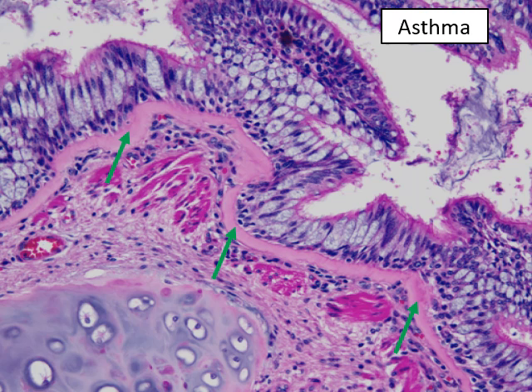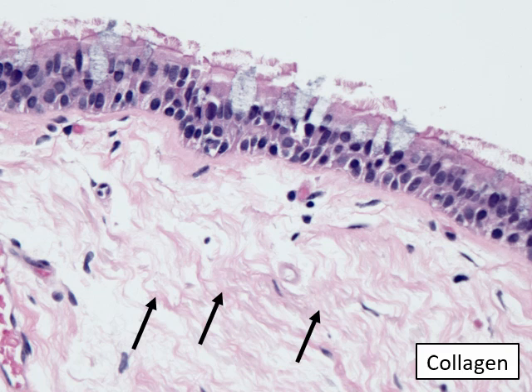This is the normal basement membrane. The asthmatic basement membrane is notably thicker. Another typical change in asthmatic mucosa is marked goblet cell hyperplasia — meaning a significantly increased number of goblet cells. This goblet cell hyperplasia partly accounts for the increased mucus in asthma that plugs up the respiratory tract and makes breathing difficult. Basement membrane thickening and goblet cell hyperplasia are two pathologic changes visible in this disease.